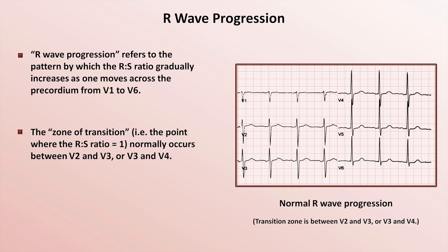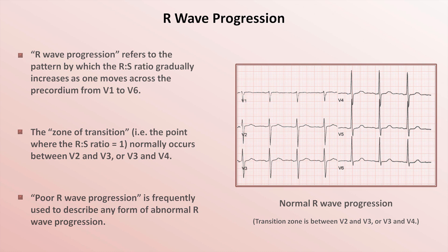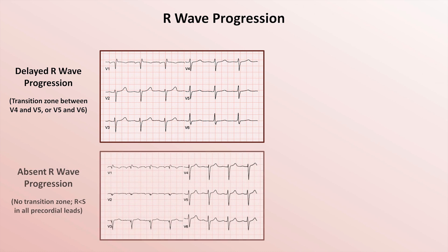Here's an example of normal R-wave progression. The term poor R-wave progression is frequently used to nonspecifically describe any form of abnormal progression. Progression may be abnormal because it's delayed — that is, the transition zone is between V4 and V5, or between V5 and V6. Alternatively, R-wave progression may be said to be absent, in which there is no transition zone at all in the conventional 12-lead EKG; that is, the R-wave is shorter than the S-wave is deep in all precordial leads.